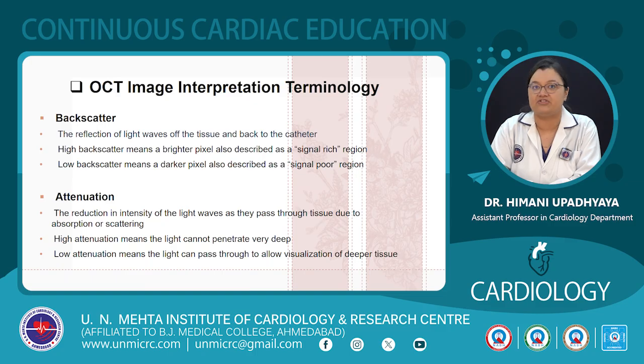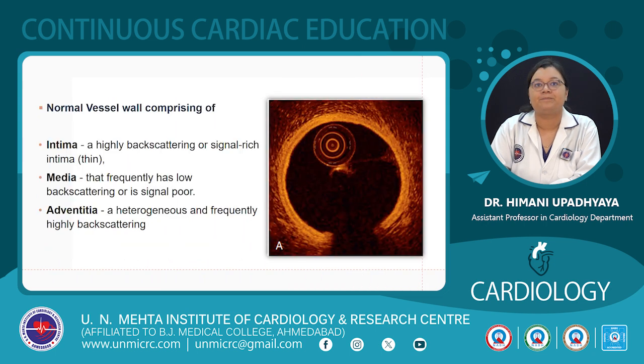Then attenuation: the reduction in intensity of light waves as they pass through the tissue due to absorption or scattering. High attenuation means light cannot penetrate very deep, and low attenuation means light can pass through to allow visualization of deeper tissue.